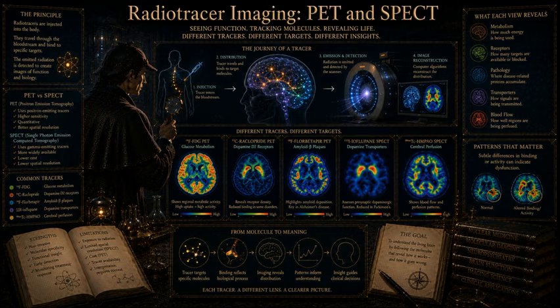If you inject a low-affinity binder with 11C-PBR28, the tracer physically cannot bind to the protein. You get almost zero specific signal, regardless of how much inflammation they actually have. That is terrifying from a research design perspective. How do you possibly run a clinical study if the tracer arbitrarily stops working in a quarter of your patients? You have to adapt. It forces the ultimate integration of precision medicine into research design.